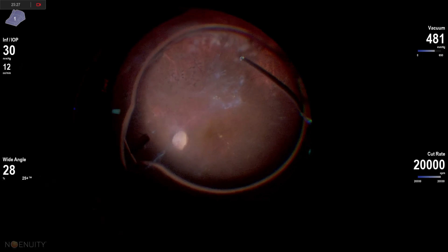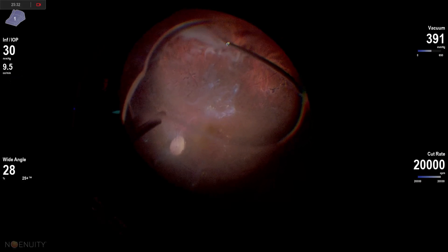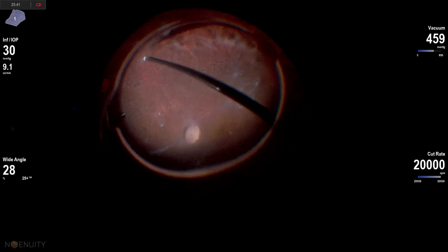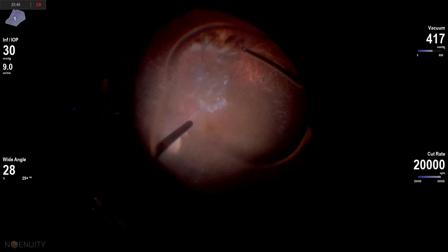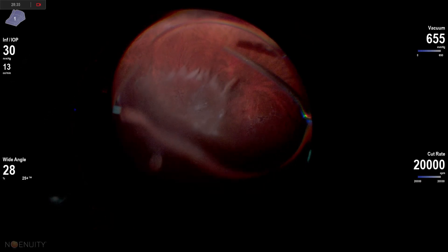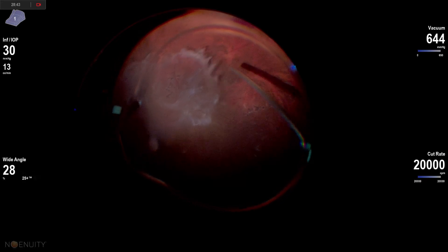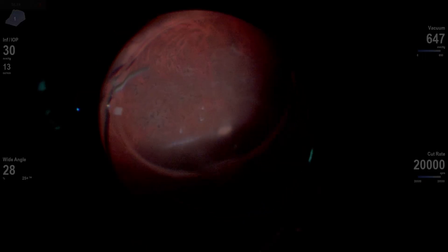You can see first I'm trying to find a plane by doing vitrectomy peripherally here. This patient has some old dehemoglobinized vitreous hemorrhage peripherally, and I'm trying to get under that to create a surgical plane between the vitreous and the retina. But the problem is that mid-peripheral vitreous between the superior temporal arcade and past the equator is just locked down — it is so tight and so bound to that retina surface that it doesn't create a lot of access to get the rest of the vitreous and the fibrotic tissue up.